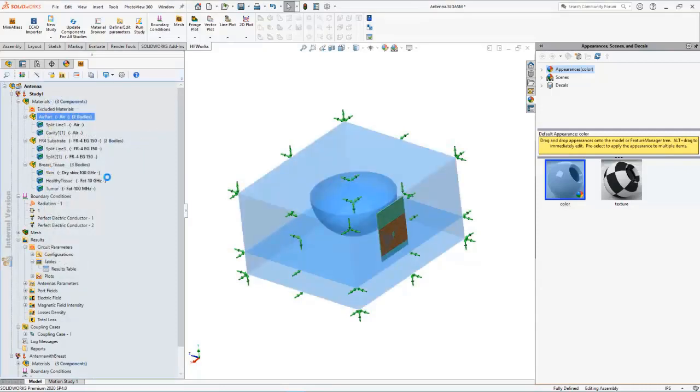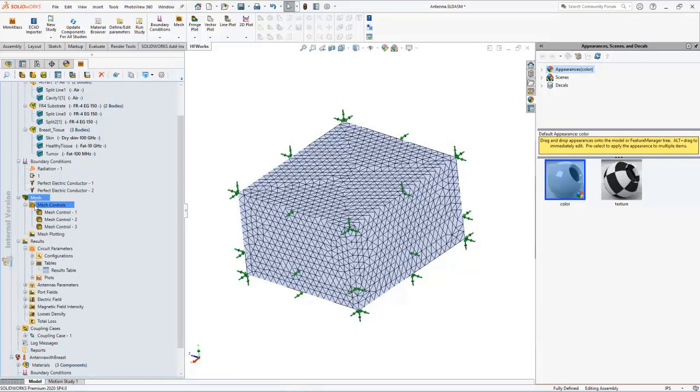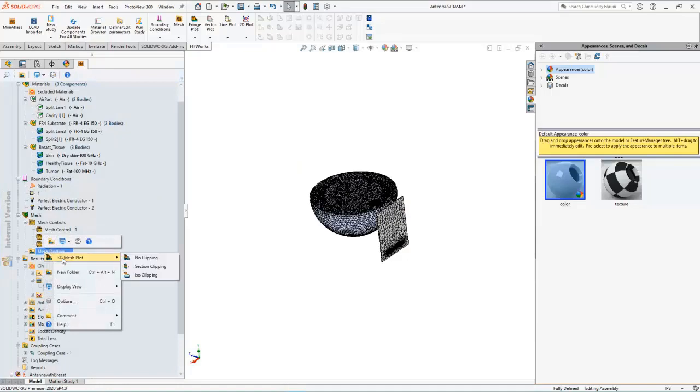The last step before running the analysis is creating the finite element mesh. So you can apply mesh controls to refine the mesh on the sensitive areas. Once the mesh is created, you can review the mesh from the outside or use a 3D plot to view the mesh elements from the inside.